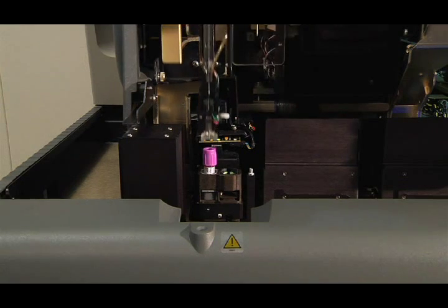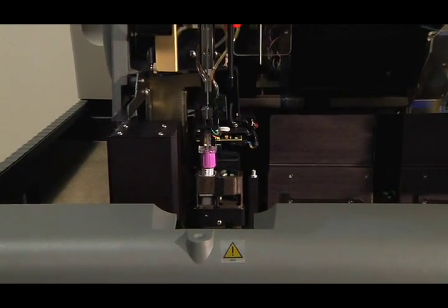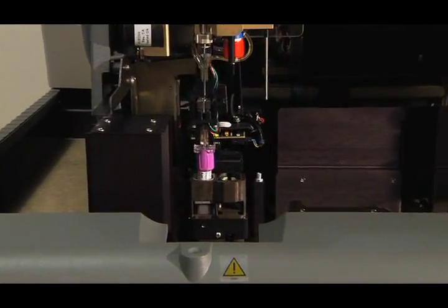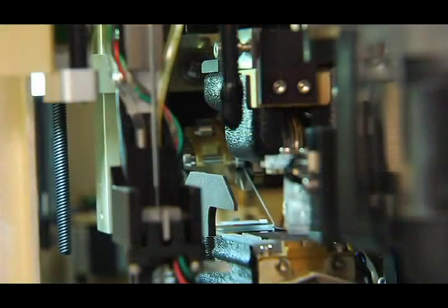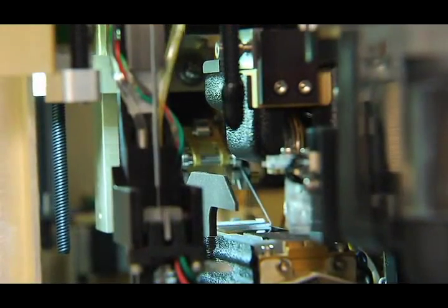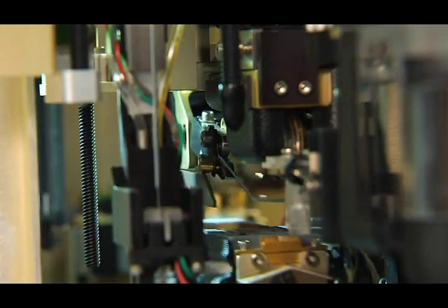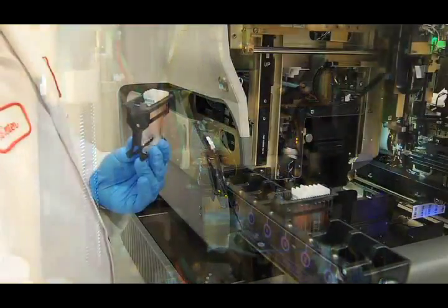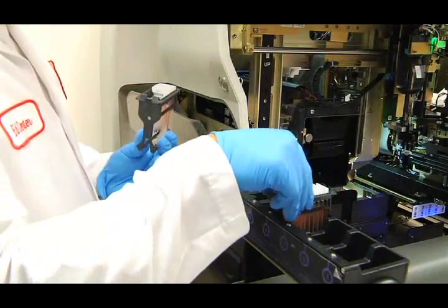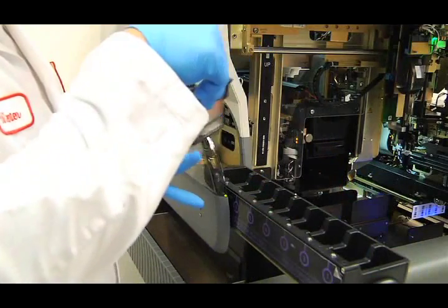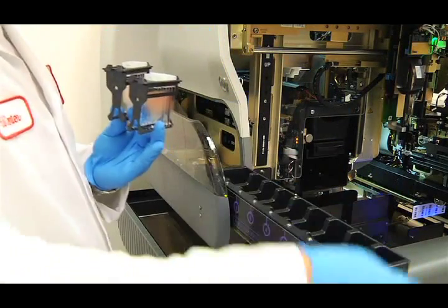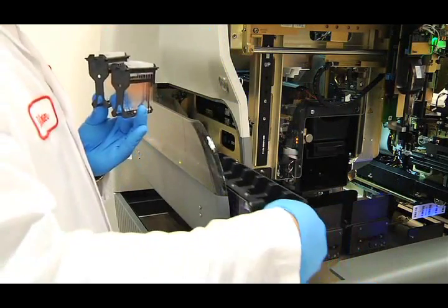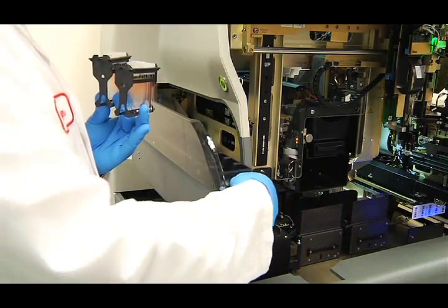The sample aspiration probe aspirates blood from the tube to make one or more smears. The system has the ability to prepare up to 12 slides from one single aspiration depending on the preference of your laboratory.